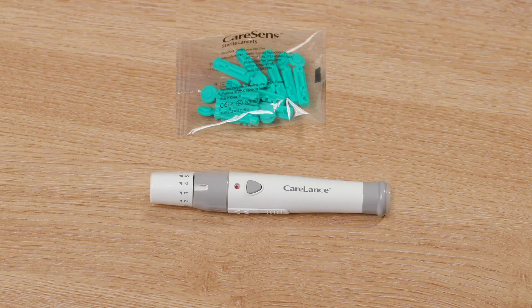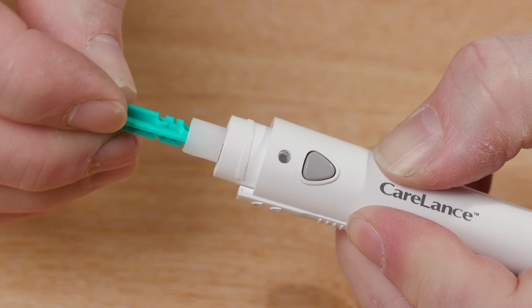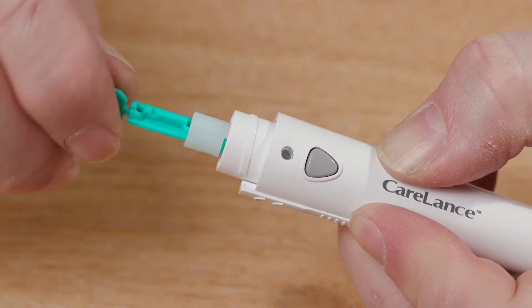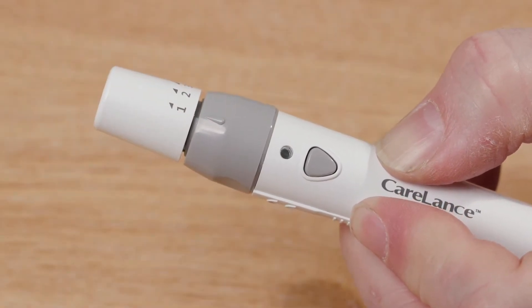Now set the test strip to one side and take out the finger prick device and the lancets. Lancets should be changed once per day as they are fine needles which become blunt very easily, which can make it harder to draw blood out of the finger. They should also be changed every day to reduce the risk of infection. I will now demonstrate how to change the lancet. Firstly, unscrew the lid of the finger prick device. Now place the long slim side of the lancet into the finger prick device. Turn the circular end of the lancet until it loosens and then pull it off. Check that the needle is not bent. Place the cap of the finger prick device back onto the body of the device. Check that the needle depth is set to 3.